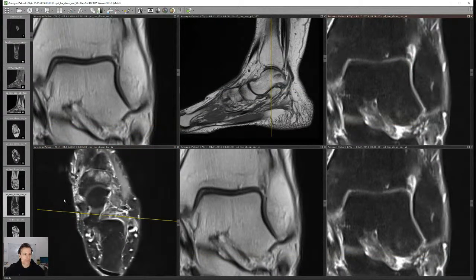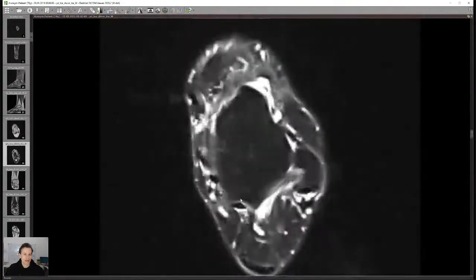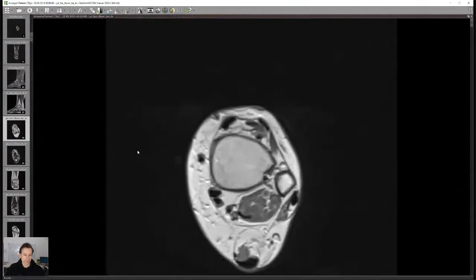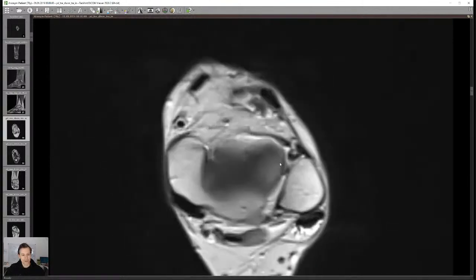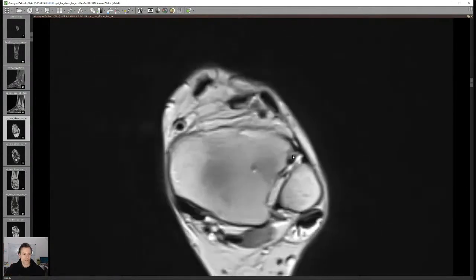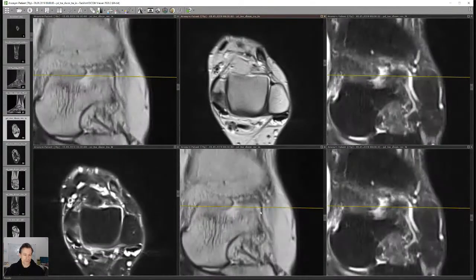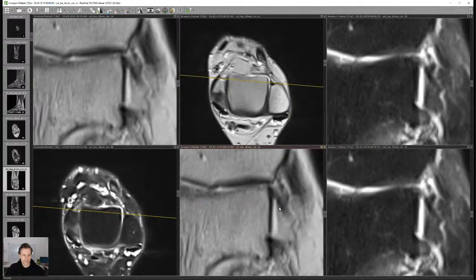Now we've been through the bones and we'll start the ligaments. I always start with the syndesmosis, as it's the most proximal portion — going through in an anatomic fashion. We have the anterior syndesmosis with different bundles visible here. Sometimes you can see a slightly separated bundle on the most inferior portion — some call it the Bassett ligament, but it's actually just the inferior part of the anterior syndesmosis.